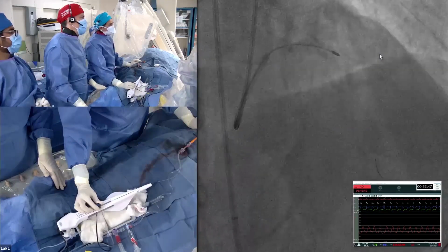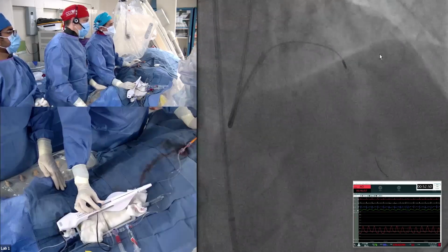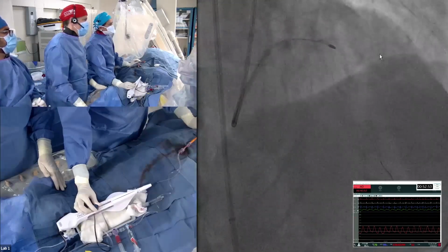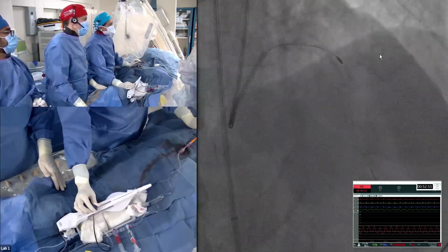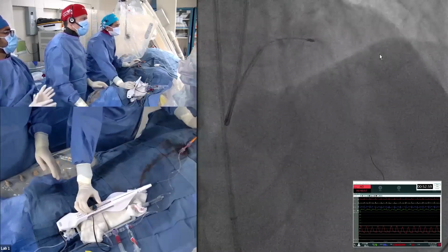So this is only in the forward motion. Also, with these small burrs, you don't want to get stuck. Sometimes you go past it and can't come back. And you see what she's doing, very slow pecking motion, going forward, slowly and slowly.